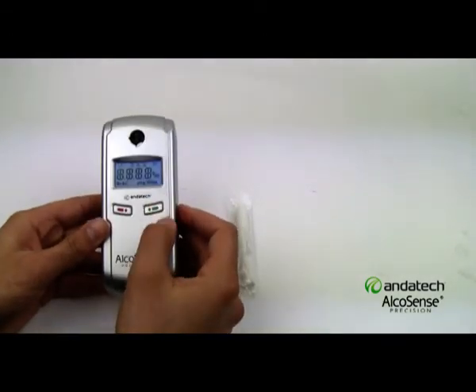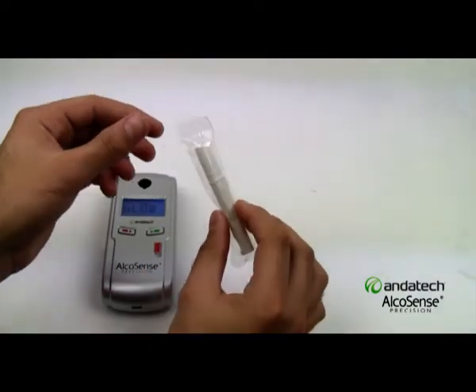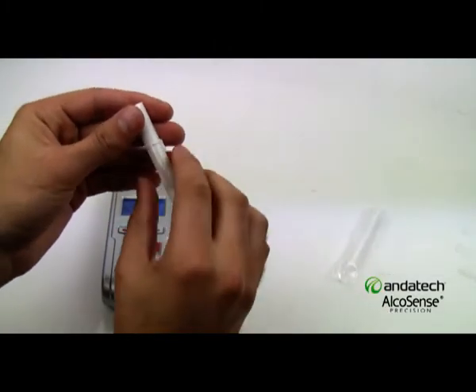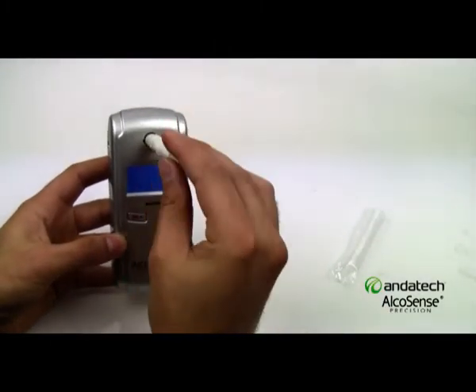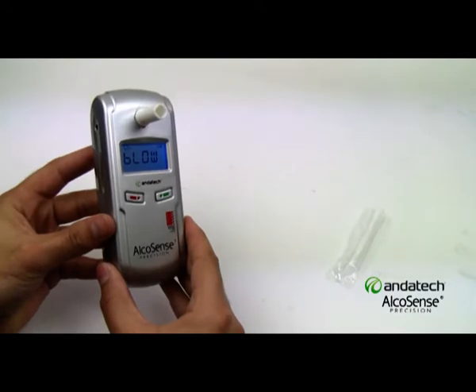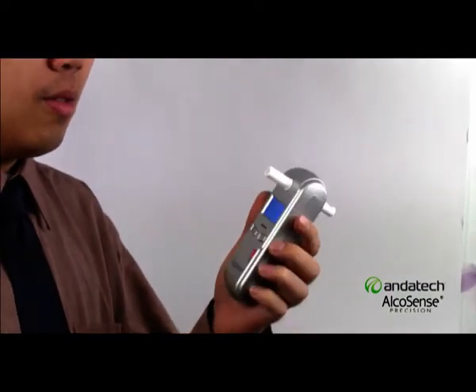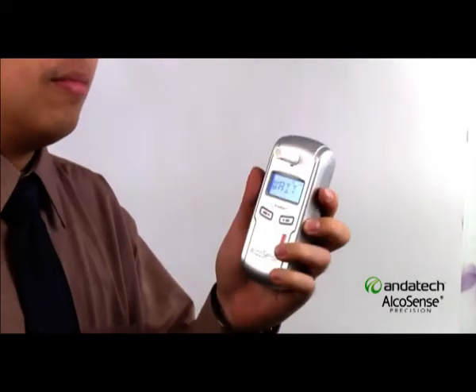Straightforward operation. Simply press the green button to turn on, wait for the screen prompt, insert the mouthpiece, and then exhale with an even and constant airflow. You will then receive a clear and accurate four-digit reading, which will indicate your blood alcohol content.